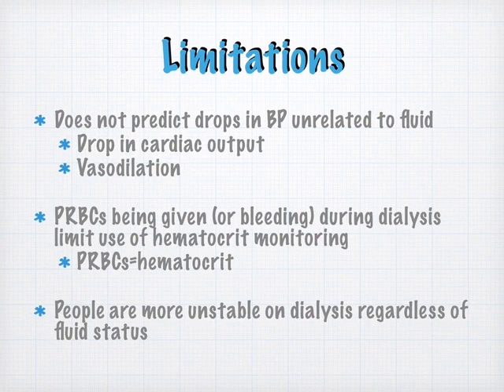I felt like if I put a person on dialysis, they had more ectopy just immediately. As soon as I would put them on, their blood pressure would have issues immediately just by putting them on the machine. They were more unstable. So I think that the hematocrit monitoring is very helpful for helping to stabilize patients, but just know that things still happen. Thank you very much.